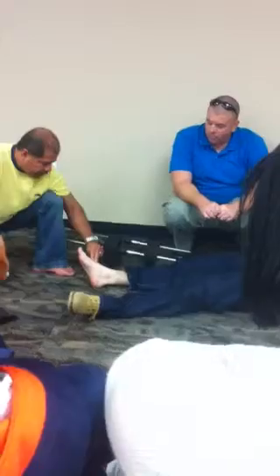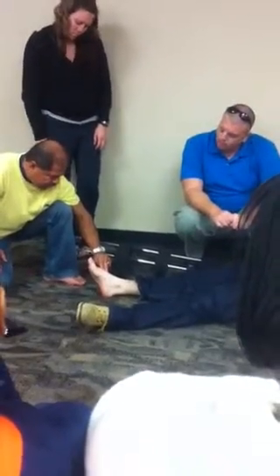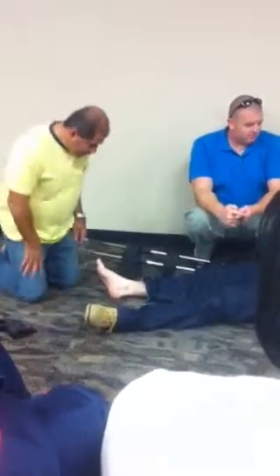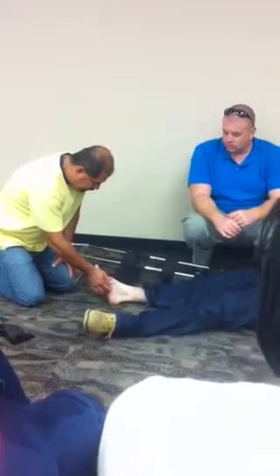So find the pulses. We were talking the other day about not knowing exactly where to. So I'm going to show you right now. I feel the pulsing right there. And normally what I do, when I find a pulse, is I make a little X right there. Especially if I've got an orthopedic injury and I want to check that, or I need to check that by Doppler. Okay? There's pulses. Wiggle your toes, partner. And you feel me touching you? Yep. Okay. Now what I want to do is put the ankle hitch on.